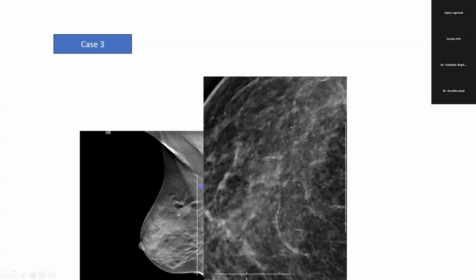This was the third case. Again, this is a very good mass lesion, with the patient presenting with this mass. But how the mammogram helped us was because of the extensive calcifications antero-inferiorly. And this patient had extensive DCIS in the mastectomy specimen spreading from one margin to the other, whereby I believe that my mammogram was underestimating the extent of DCIS in this case.